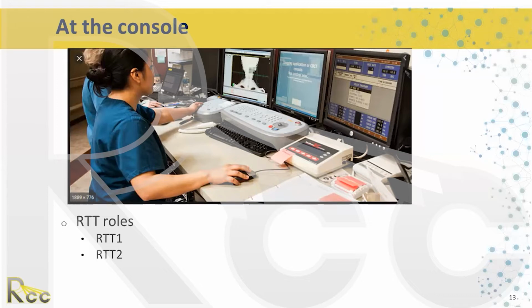And then it's really important that you both watch the treatment the whole entire time, make sure the patient doesn't move. So nobody should be walking around. The second therapist should also be paying attention, updating any notes as needed. Nobody should be on their phone or anything like that. Sometimes I see therapists on their phone, but you should both be very diligent about paying attention, making sure the patient doesn't move, that the treatment's going correctly.